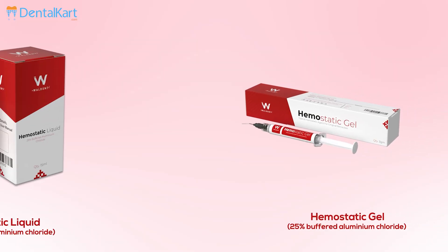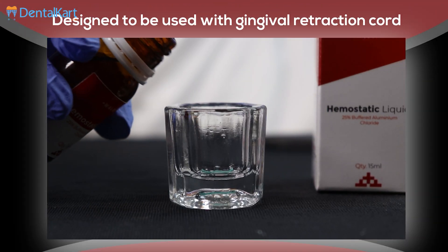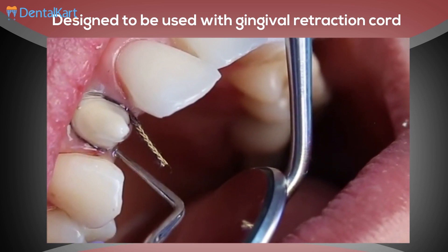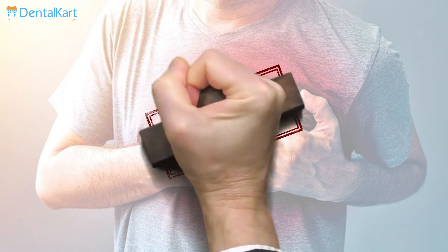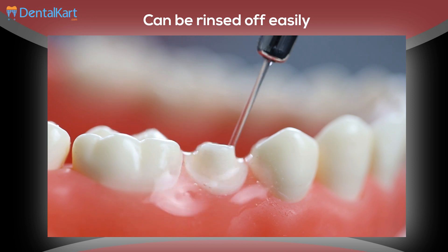It comes in both gel and liquid form. It is designed to be used with gingival retraction cord to control bleeding, and also as a lubricant to facilitate the insertion of cord into the sulcus. It does not stain hard and soft tissues, which is especially critical in the aesthetic zone, and it does not present any cardiovascular problems as it does not contain epinephrine. It can be rinsed off easily.